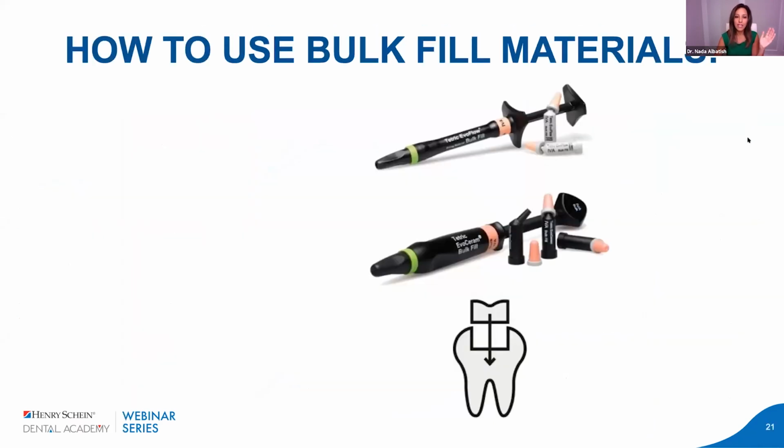Okay. So I want to take a step back and talk to you about how to use bulk fill materials. Because as a clinician, and as a graduate of the University of Toronto in 2007, at the time, I was not comfortable using bulk fill materials because we really learned about our conventional composites and about not layering thicker than 2 millimeter increments because of the shrinkage stress on the restoration.